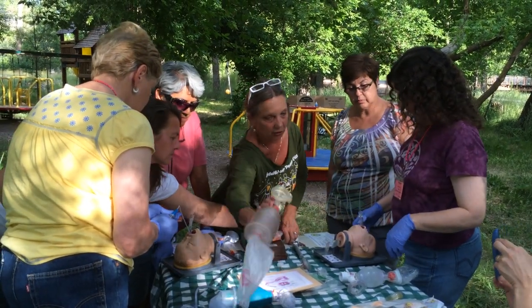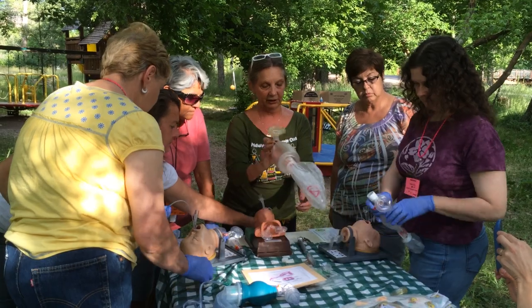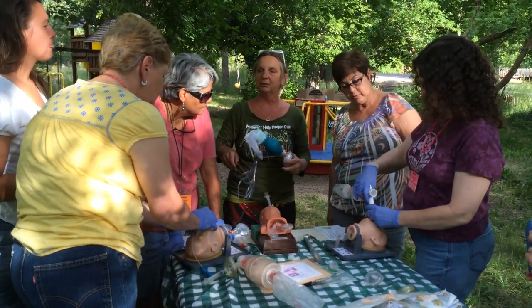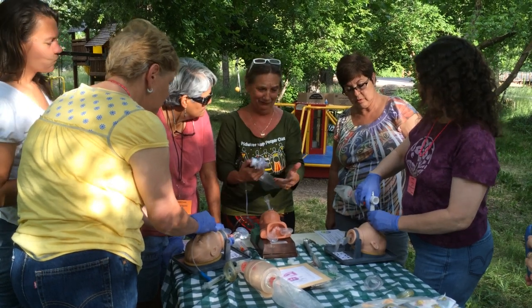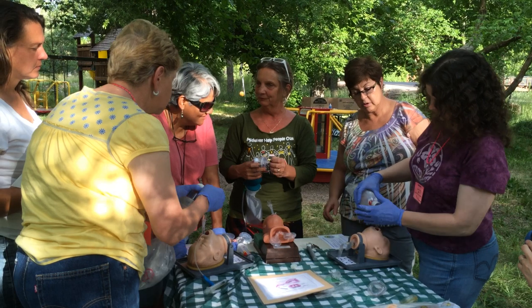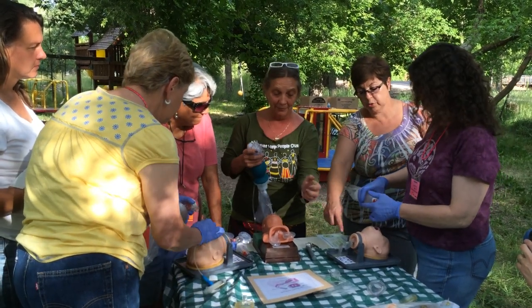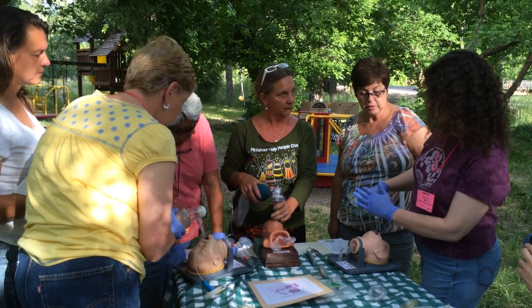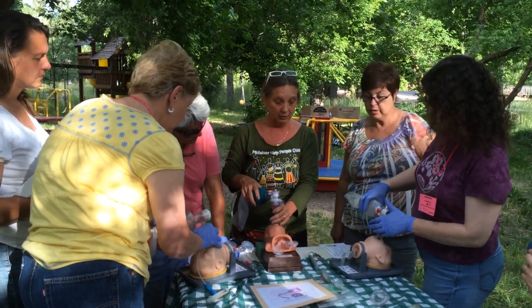You take your mask off, your bag mask ventilator. And it's important to do that so your muscles remember, because otherwise you'll be standing there going, how did Andrea sit up? I got this mask on here and it's not fitting. So when you're doing it, pull the mask off and put it on. You have to cover this? What is this? That's it. Now? Just like that?